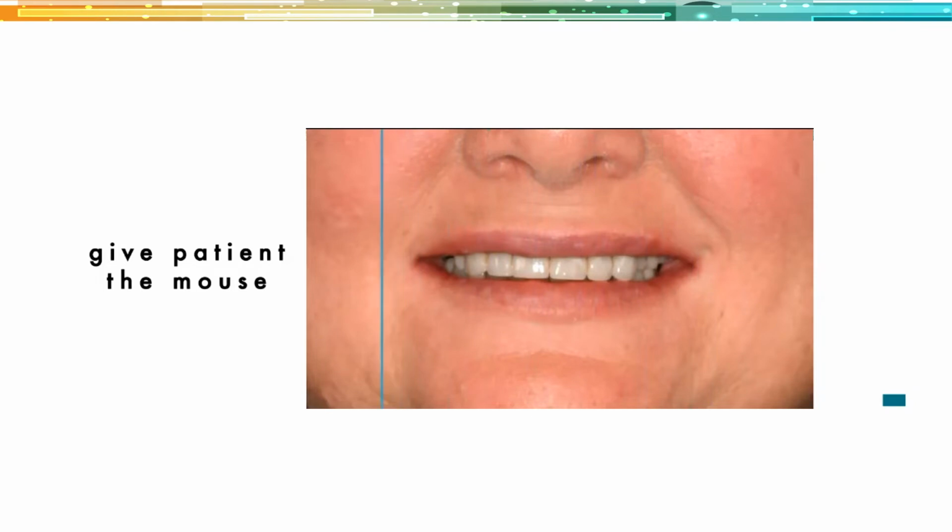And you start to really understand what they want. So every patient says they want a white smile. I want to know at least whether they're talking about a natural white smile, like an A1 or maybe a B1, or are they talking about a really Hollywood kind of unnatural 0M1? And I want to know that before I treat the patient. So if I show this to them and they say, "Ooh, that's way too white," then I know that they are looking for a little bit more natural cosmetics and color. And this is really invaluable.